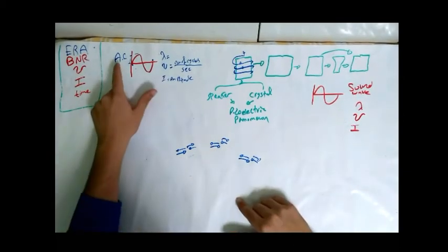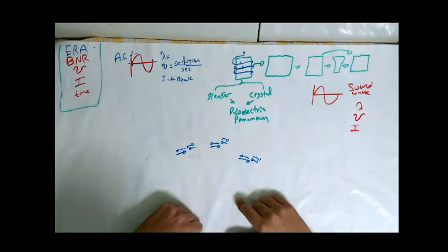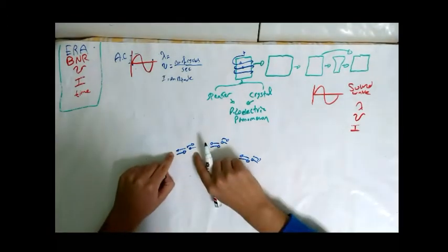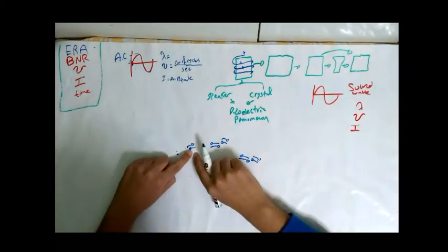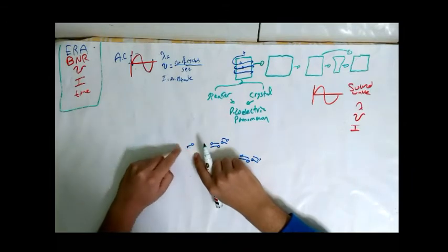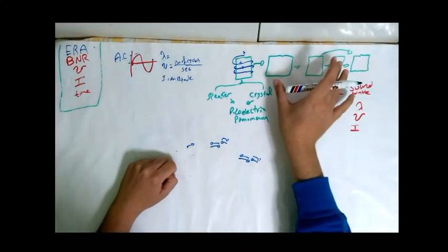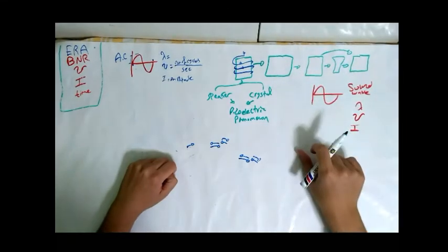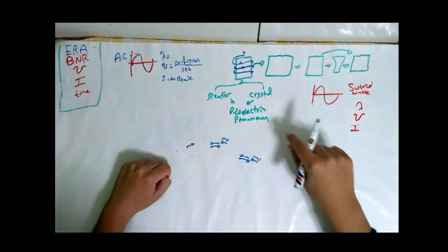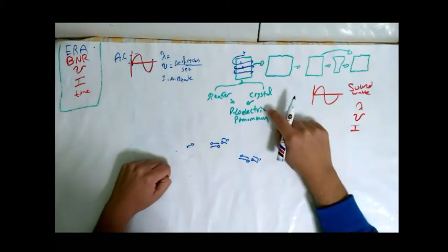First, you must have an alternating current, not direct current, because in direct current, electrons will not move like this. Electrons will only move forward. So when this current moves inside the coil, it will not form a deformation or change in the shape of the crystal. The second prerequisite is a material that has the piezoelectric phenomenon.